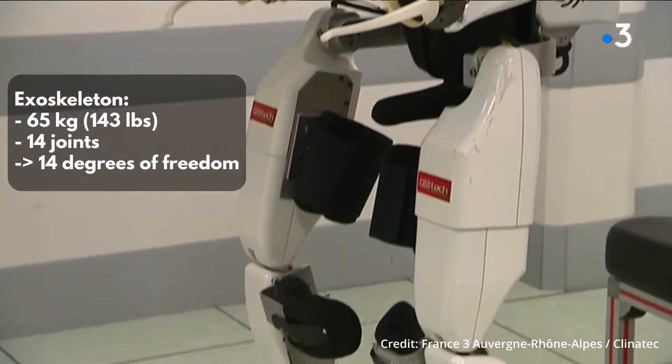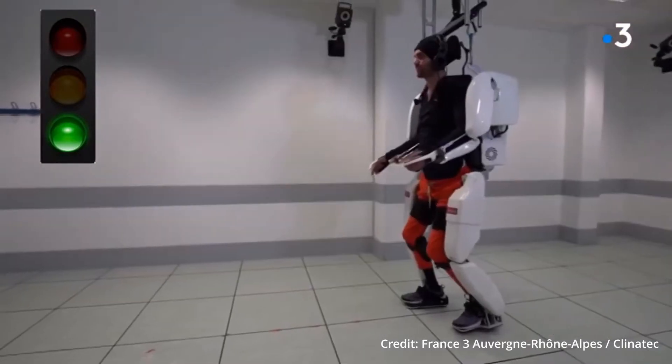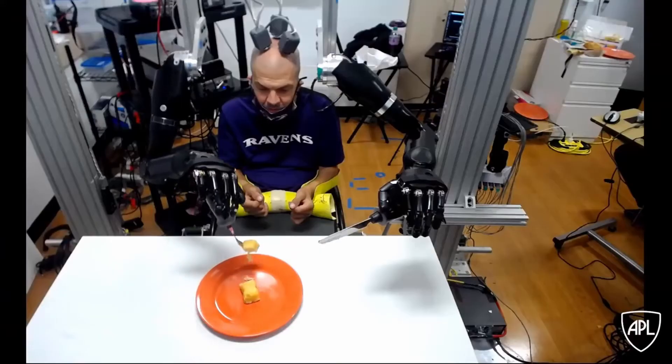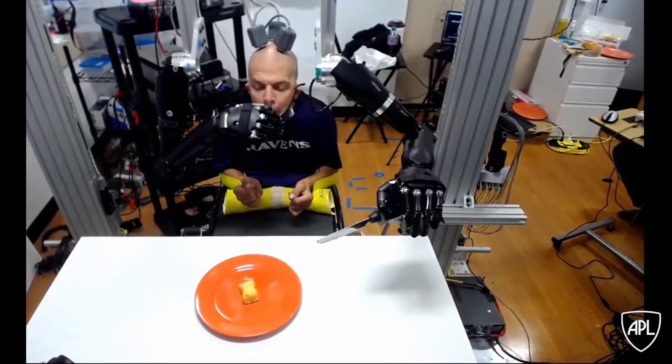This person was able to move a very bulky and complex exoskeleton with 14 joints and 14 degrees of freedom, weighing about 65 kilograms. Seeing a quadriplegic person move again with this exoskeleton is amazing in itself. But can we do even better? More recently, studies have highlighted the potential for brain-computer interfaces to move robotic arms. In late 2020, a study from Johns Hopkins University showed amazing results — a patient was able to feed himself dessert with mind-controlled robotic arms. But brain-computer interfaces are not the only challenge; taking information from the brain and transducing it into control is an already incredibly complex task on its own.